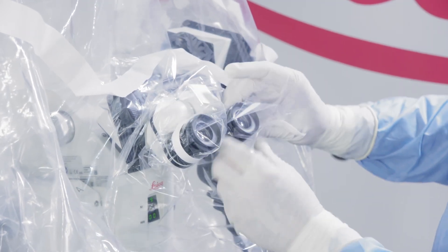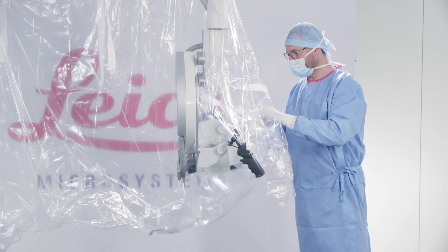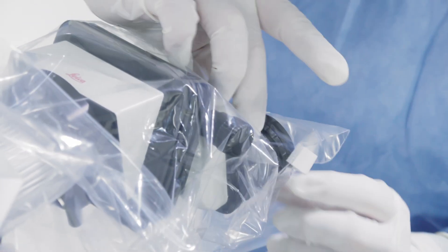Secure the eyepiece covers using the Velcro straps. Then use the other binocular covers, depending on the number of binocular tubes to be draped.